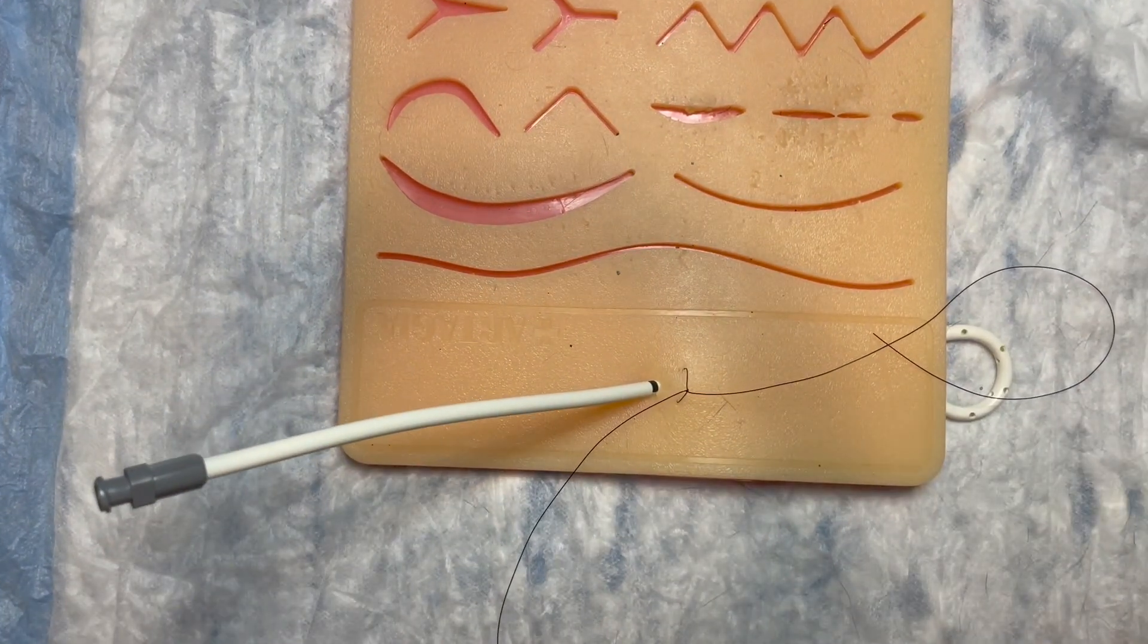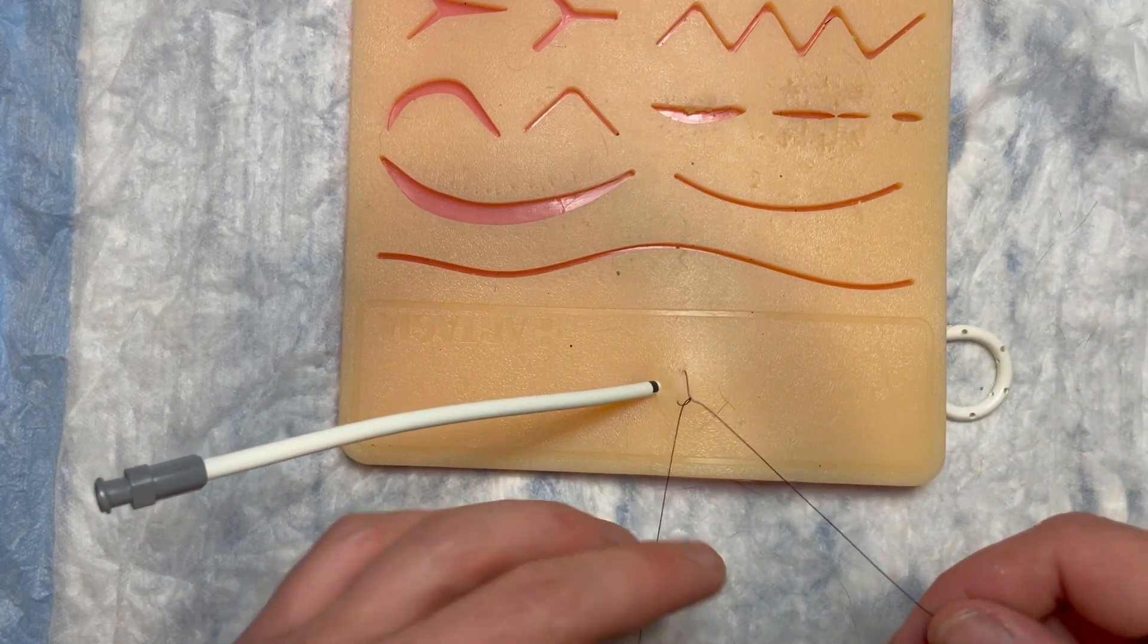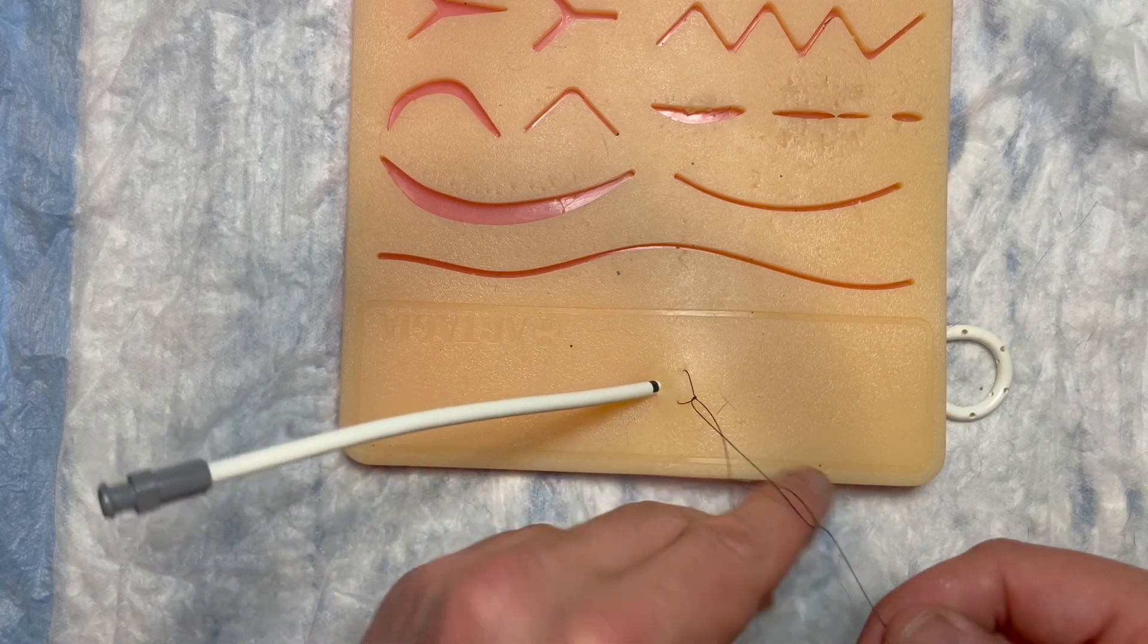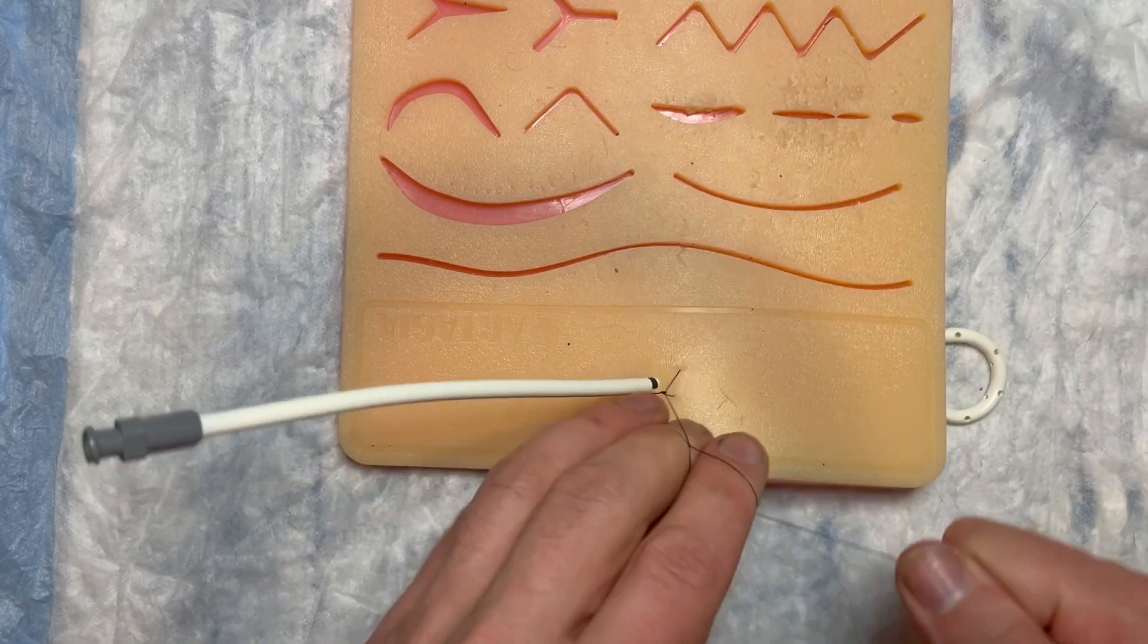If I did a square knot I wouldn't be able to do that. So now that I've got this down to the level that I want, I'm then going to secure it like I would any other knot and create a square knot here.